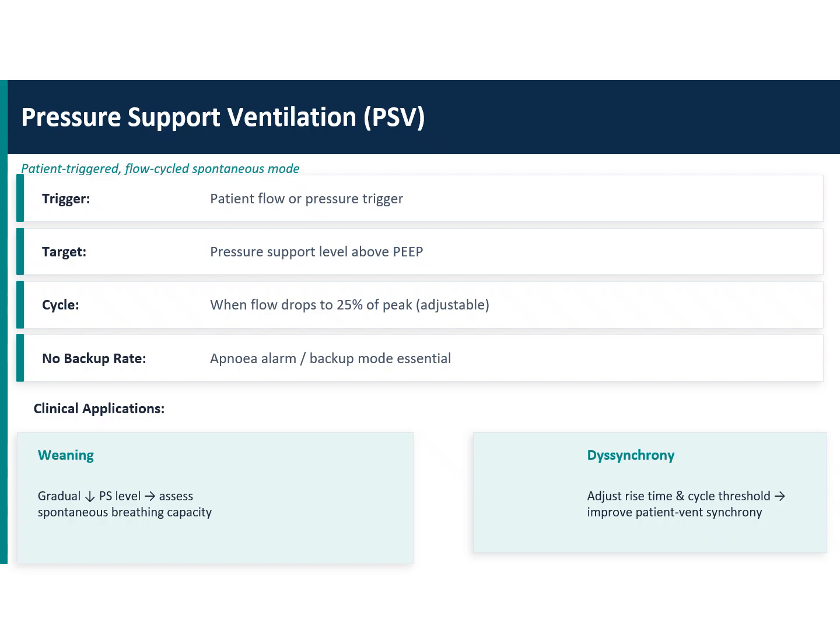So you have to change the strategy. You definitely want the patient to have a respiratory effort, so you're not going to have a deep sedation. You are going to sedate the patient mildly. You can use propofol or Dexmed in these patients, and put the patient on pressure support ventilation.